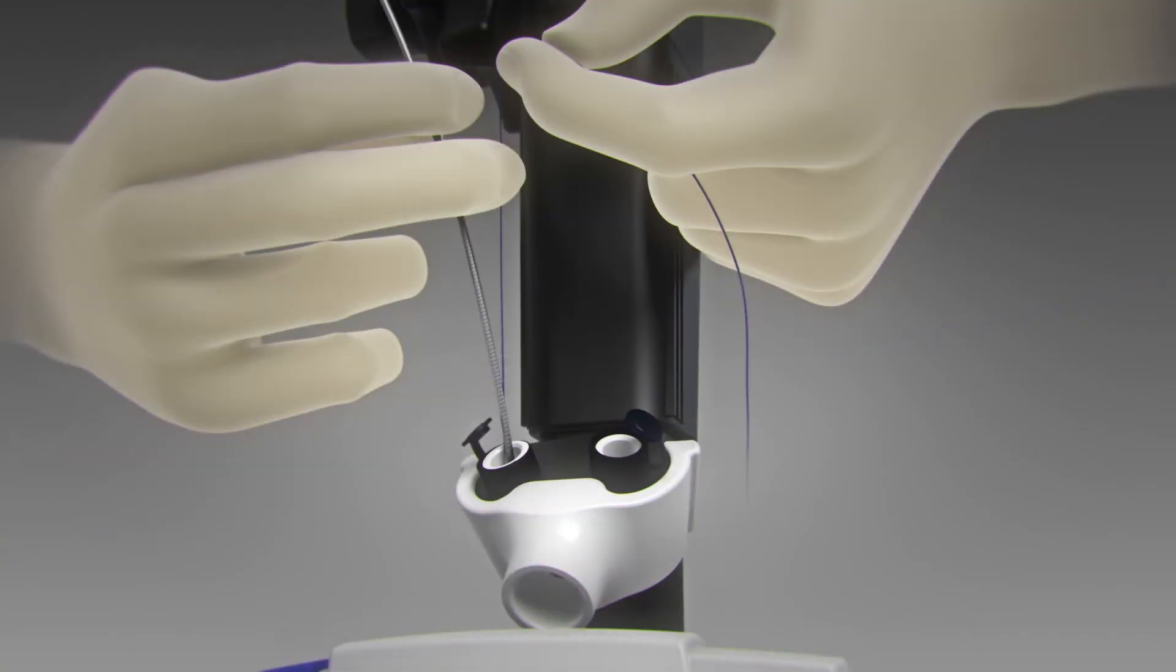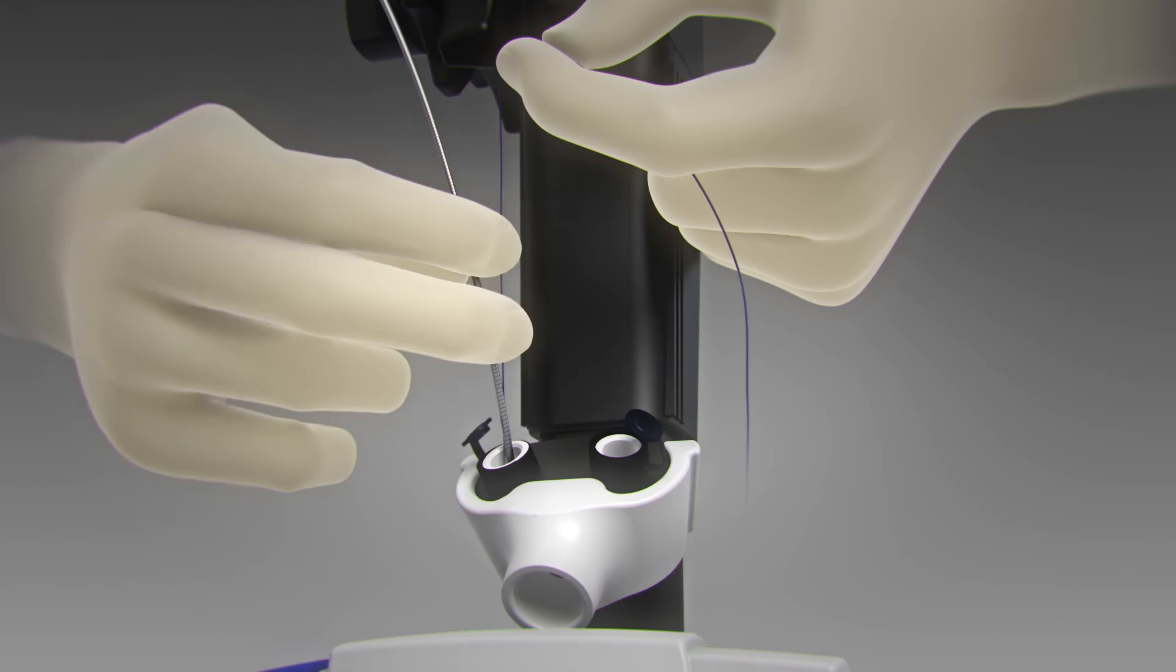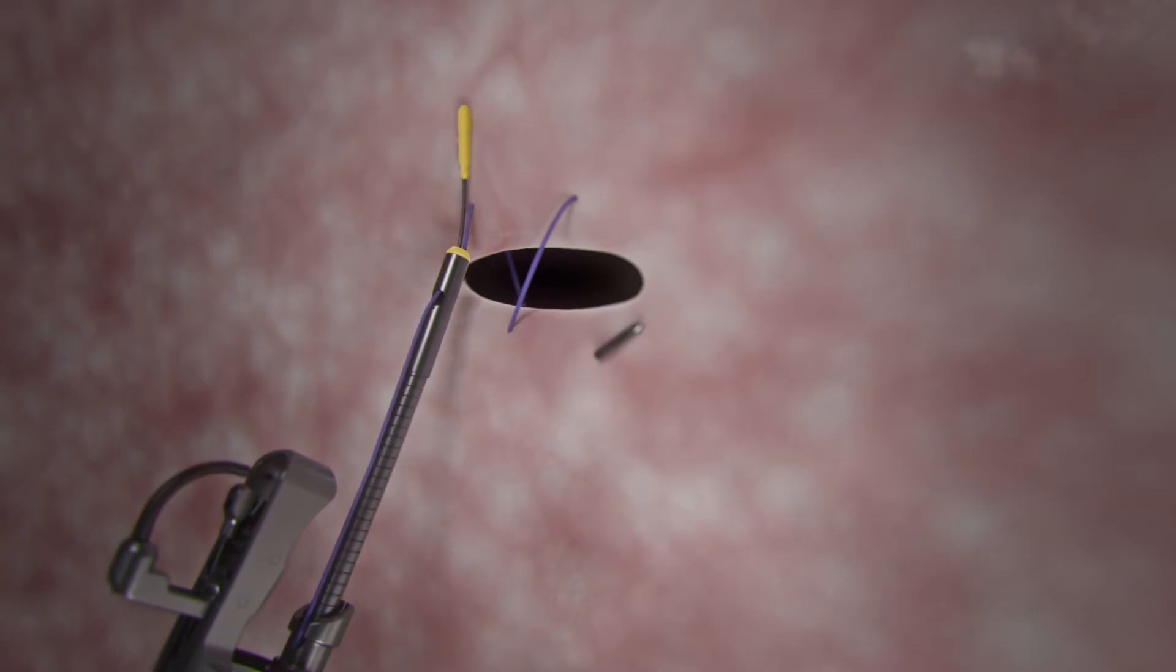While holding slight suture tension, insert the cinch into the 3.7 millimeter channel of the scope. Advance the cinch catheter until it extends approximately 3 centimeters past the overstitch end cap, targeting the placement of the first bite.